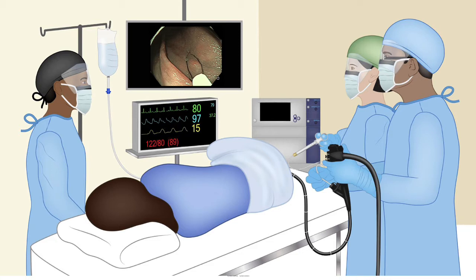The key fact to keep in mind as an endoscopy assistant is to work with the endoscopist. When the endoscopist asks you to cut, you should cut it fast. When you cut it fast, the polyp will get transected easily. On the other hand, if you cut it slowly, then it becomes like a drag to cut through that submucosal tissue.